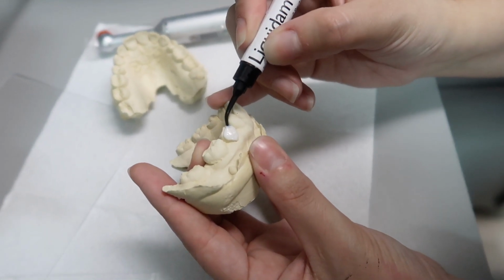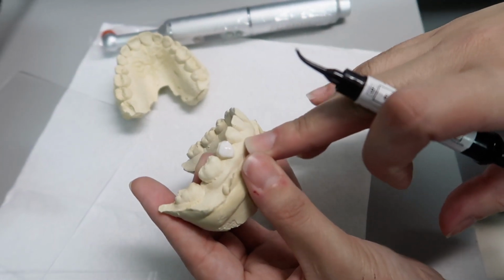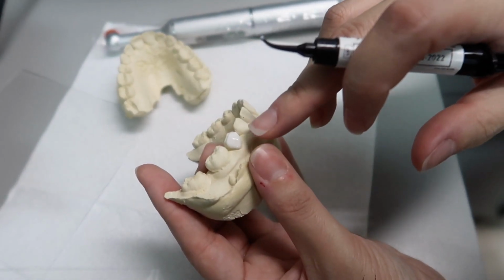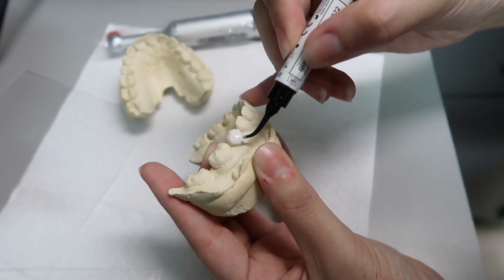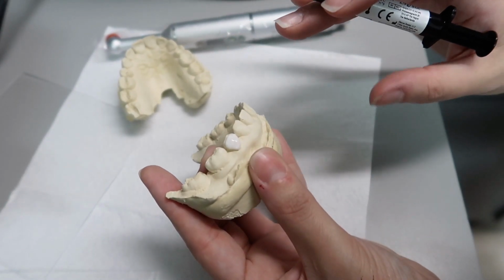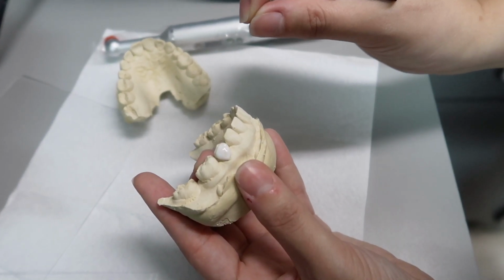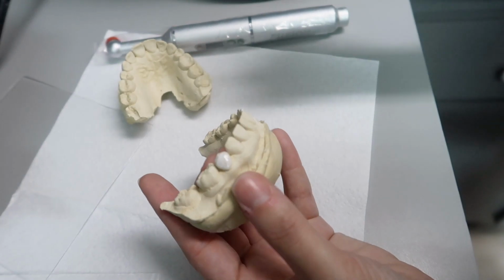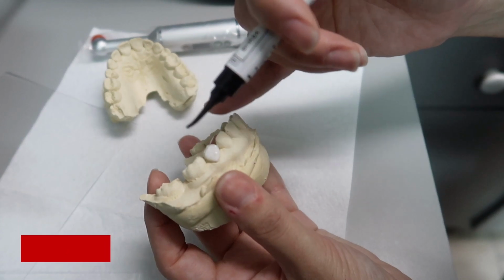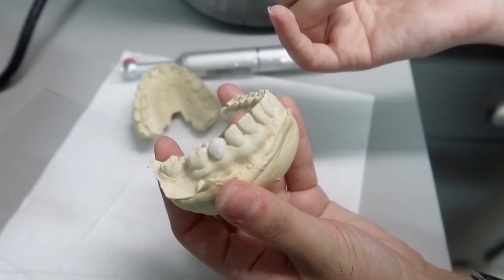Yes, there you go. So, okay, this is also important. Let's say your patient has abfractions or recession areas. You don't want them to put the gel there. So when you're doing this barrier, you're not going to go over the recession or the abfraction area. You're going to leave that alone, because the tray is going to be super tight on that area and gel is not going to get in there, and if it does, it will be very little. And when you're doing this, you don't want a huge blob. You want it to look kind of smooth and not too big.